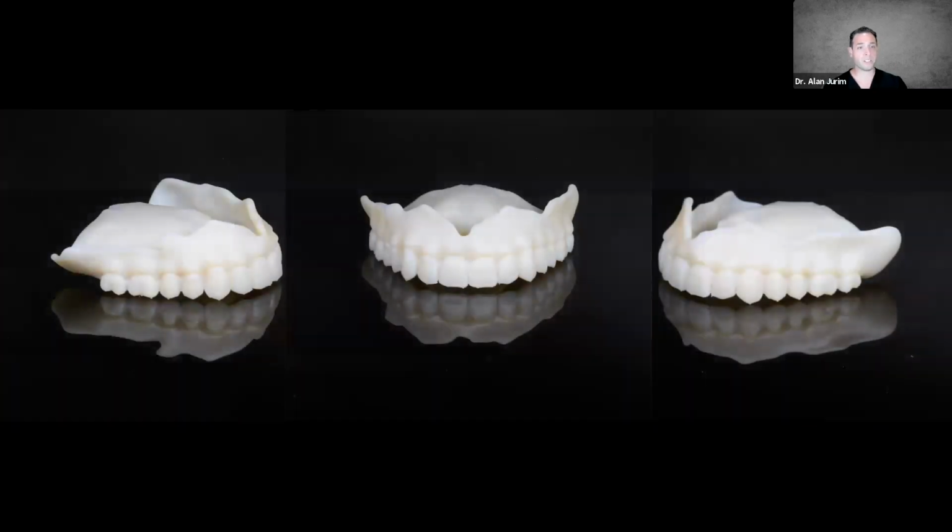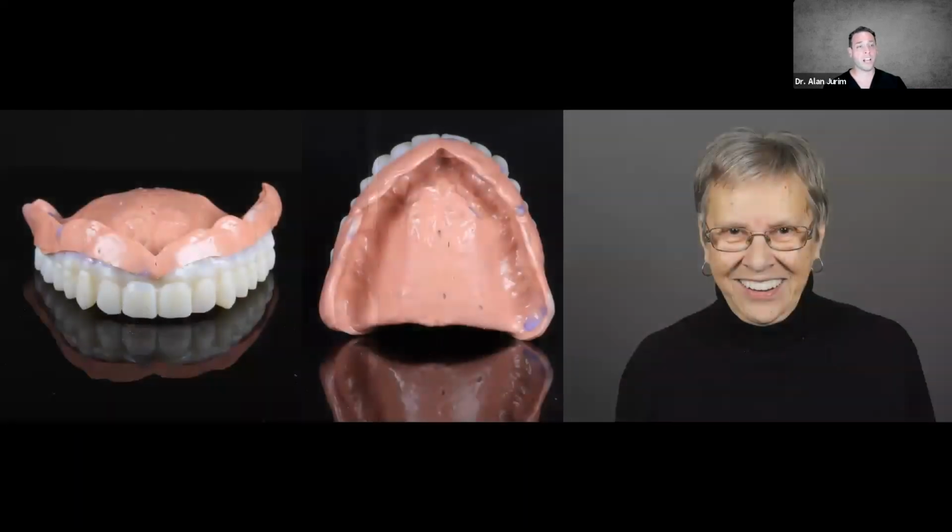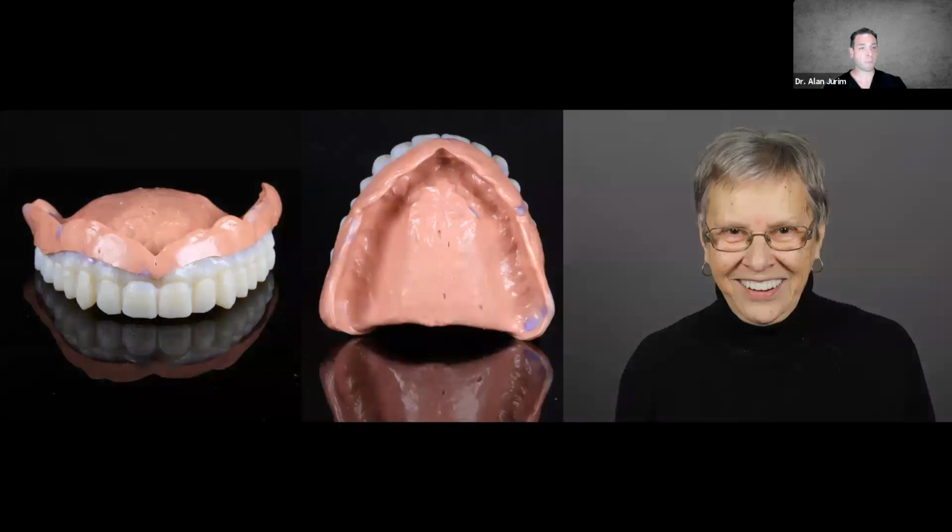So here is the patient's actual denture that we had from before. Once we Trios scanned it, we printed it in B1 resin, and then we took that B1 resin and we used it to help border mold and adapt and realign it within the mouth. And this process is during the second visit. It's relatively quick. My sister is a prosthodontist.